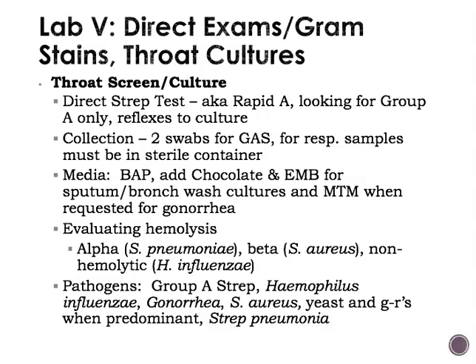That same swab, you're going to inoculate to your blood agar plate, but it has to incubate. Whereas you can report out those kit test results in 5 or 10 minutes, you would have to wait the following day to look at the growth on the blood agar plate.